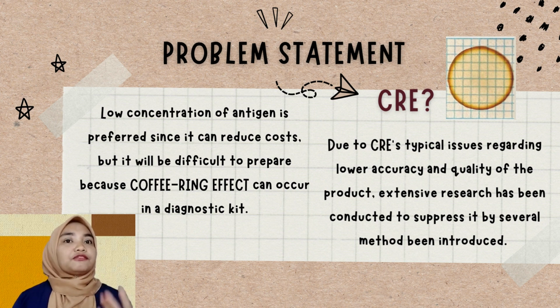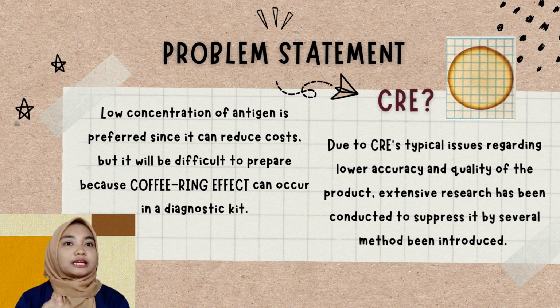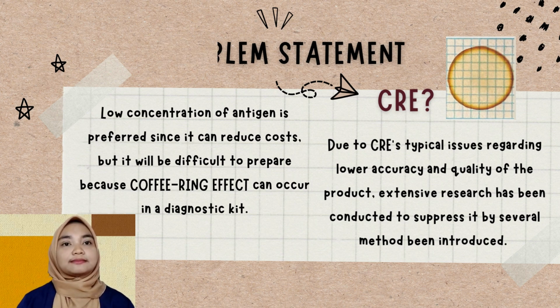Coffee ring effect refers to a condition when a liquid drop that dries on a solid surface leaves a ring-like deposit behind. When CRE occurs in the diagnostic kit, it will appear like a stain, fade, or discoloration on the visual of the test result obtained. The disrupted result appearing on the diagnostic kit contributes to confusing and false interpretation of the result. The result of the diagnostic kit image could be confusing to the users.